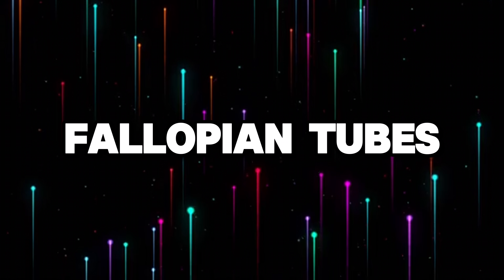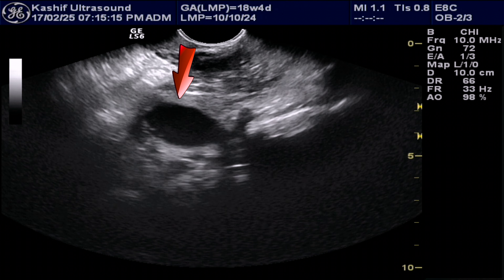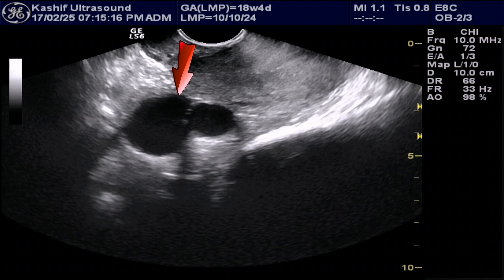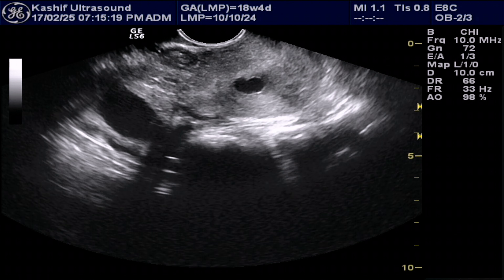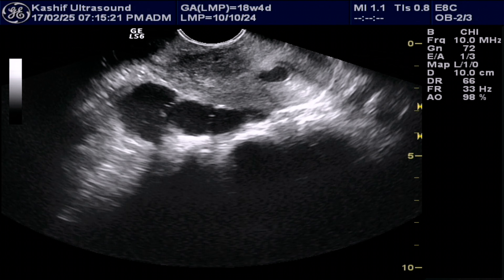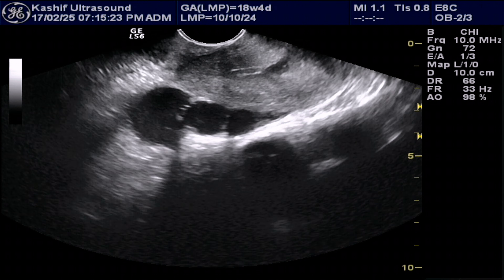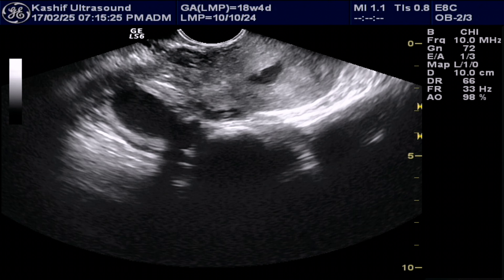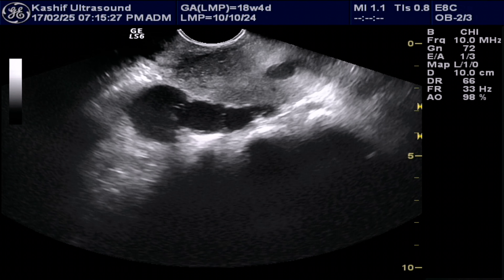Ultrasound can detect dilated fallopian tubes, also known as hydrosalpinges. These are elongated, curved, fluid-filled cystic areas located in the adnexa, just adjacent to the ovary and uterus. They can also cause infertility.